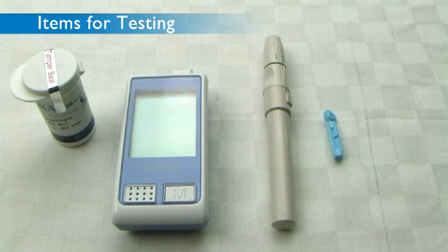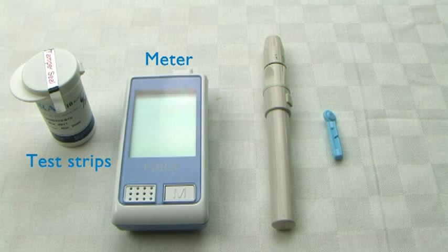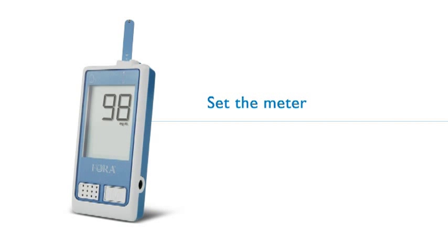Items for Testing: Meter, Test Strips, Lancets, Lancing Device.